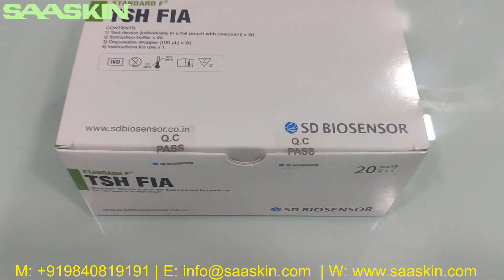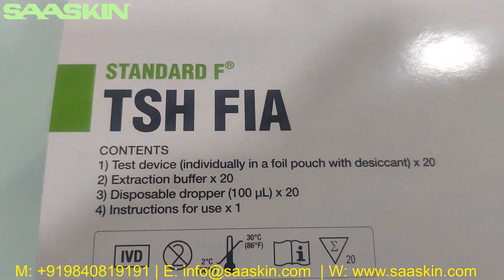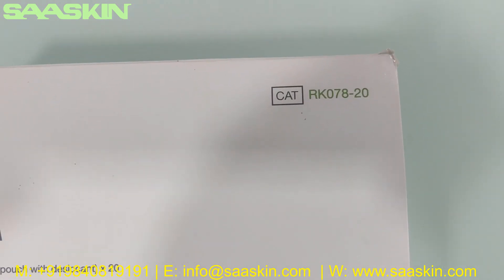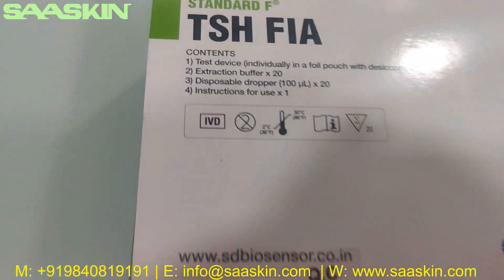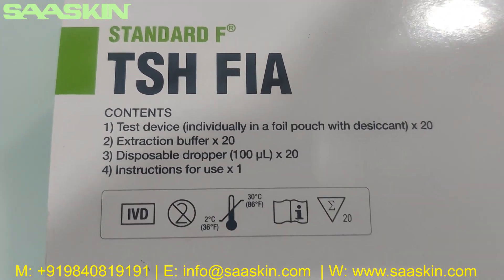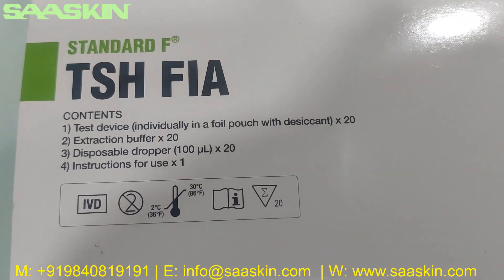Hello everybody, today we are going to see the unboxing of SD BIOS Sensor STANDARD-F TSH FIAT Test Kit. This is catalogue number RK078-20, a 20 test kit pack. It is an IVD certified product and can be used at room temperature. It contains 20 test devices, 20 extraction buffers, and 20 disposable droppers.